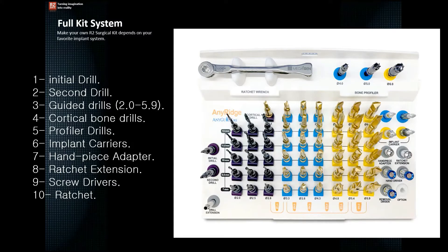The other option is a full kit, which is what we have in front of us right now. The components of the full surgical kit include: the initial drill, second drill, guided drills, cortical bone drills, profiler drills, implant carriers, handpiece adapter, ratchet extender, screwdrivers, and a ratchet.